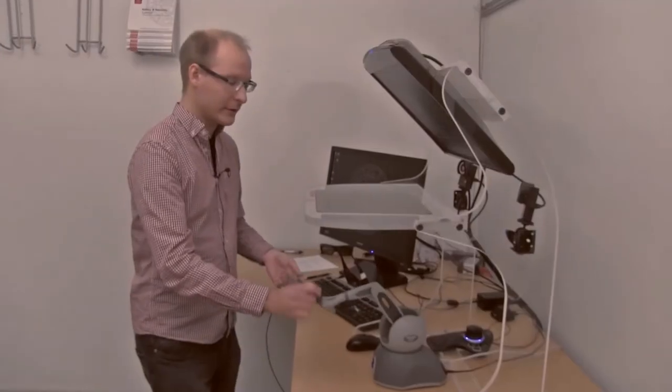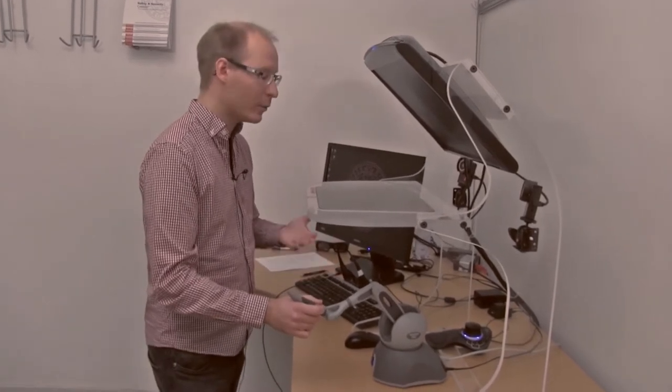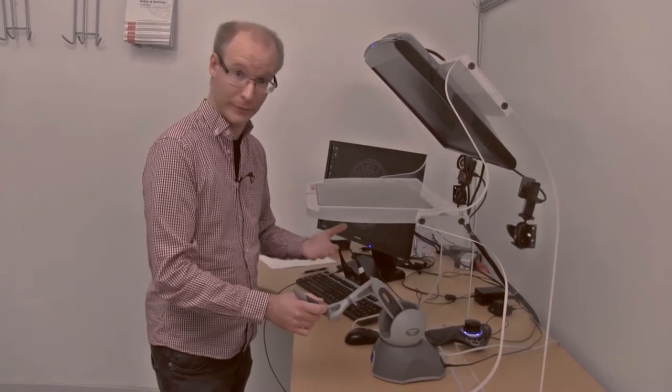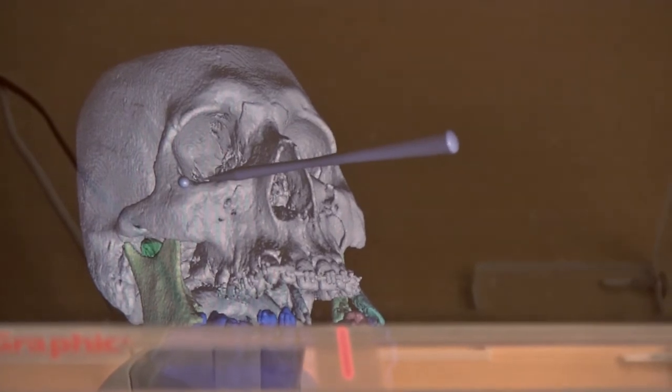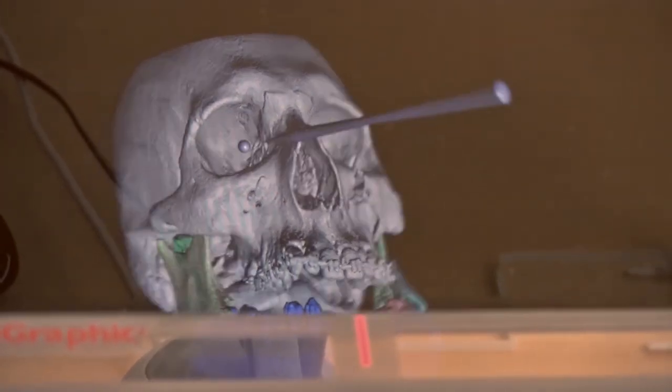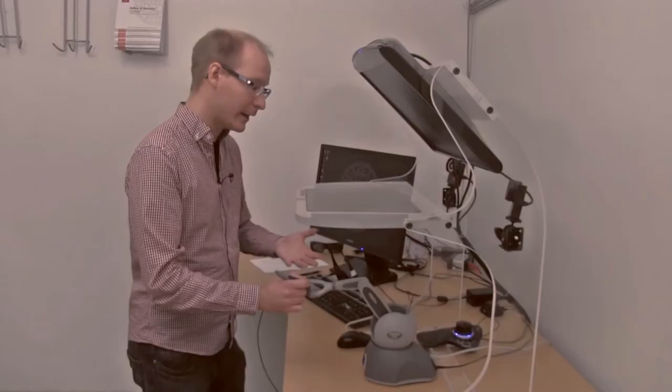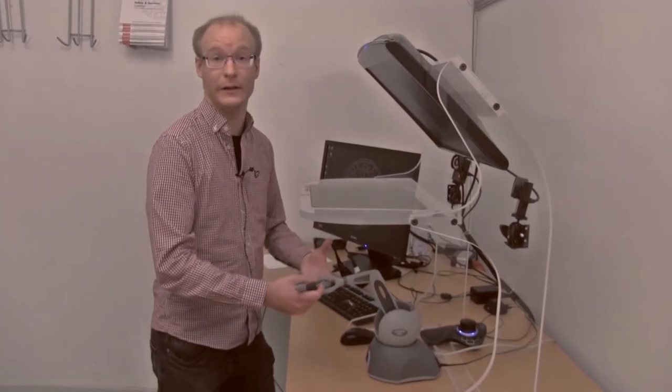So basically the pen controls a three dimensional cursor in the program. And whenever that cursor is in contact with the three dimensional model of the patient's skeleton, I can feel that contact as a very hard and stiff contact. And I can also use it to pick up pieces of bone, for example, and put those together. And when they are in contact, I can feel the contact forces.